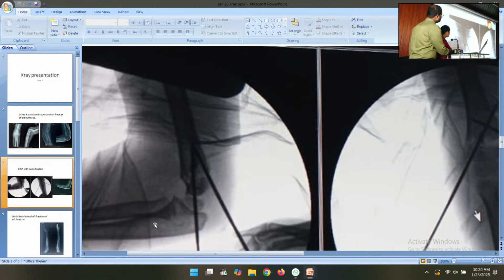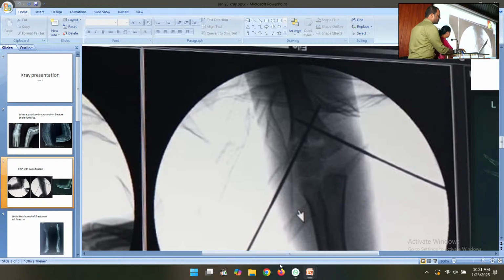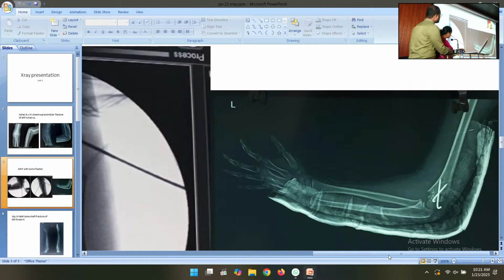So you have improved the position, but not the rotational deformity. This is very important, as it is more responsible for the cubitus varus deformity. This hyperextension may not be of great importance. Internal rotation is the one that should be prevented. Here you see this is overlapping. It appears as if it is aligned, just spurious. The X-ray shows it slightly medially displaced. See again, very clearly seen. So much of it here, and this is the true lateral of the distal fragment.